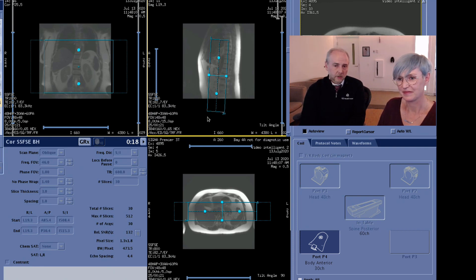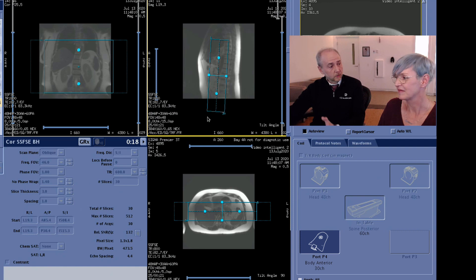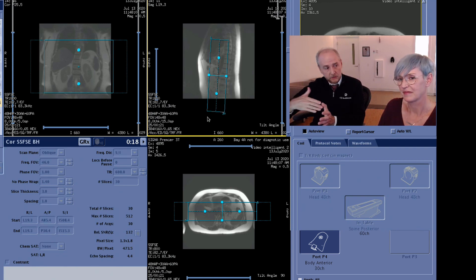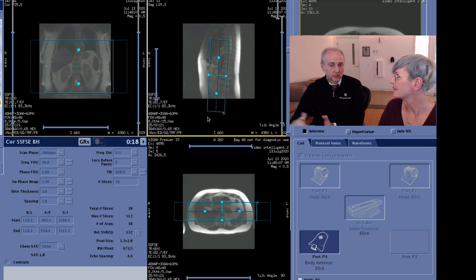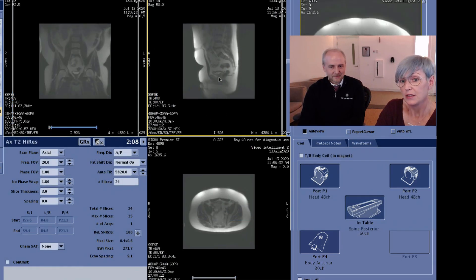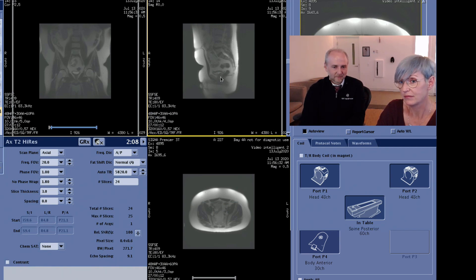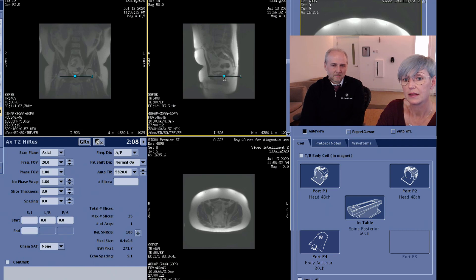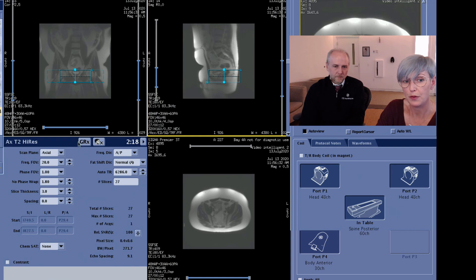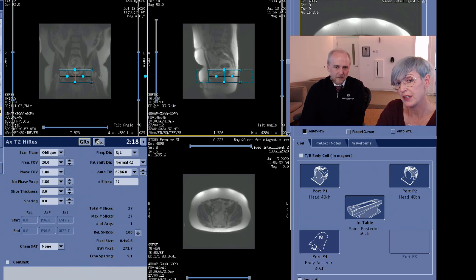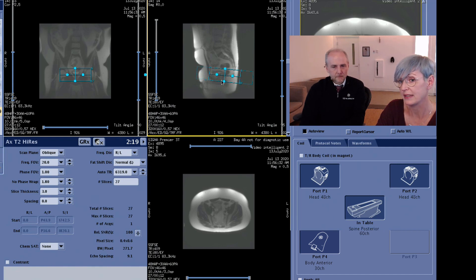Another nice feature about AirTouch: with the Air Coil on the table, you're able to image quite an extended coverage through the z direction. The coil is quite long, so you can simply place it over the patient and get a chest, abdomen, and pelvis without having to reposition the patient or the coil. So now we are switching from the liver all the way down to the prostate without changing the patient setup or the coil setup. I just go ahead and prescribe the prostate and the pelvis, and you can see how much coverage I still have left — I can go all the way down until the coil coverage ends, giving easy access to the entire pelvis as well.